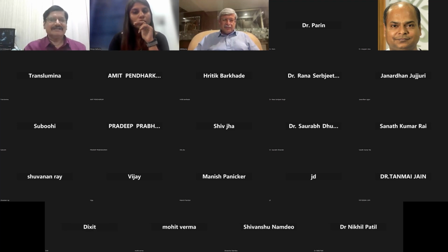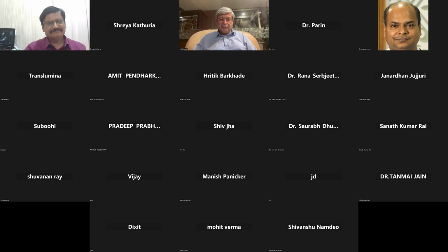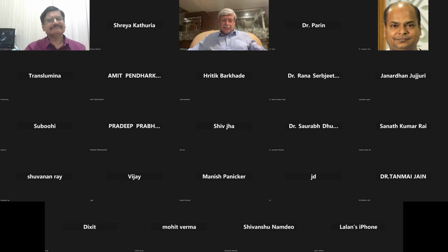In some cases, if it's a very heavy calcification in CT angio, this could be a pointer that plaque modification would be necessary in the form of rotatripsy. Either a rotablation is necessary, or on top of that something like IVL. So CT angio could be a pointer. It is a very nice finding what he presented, that he could correlate that.